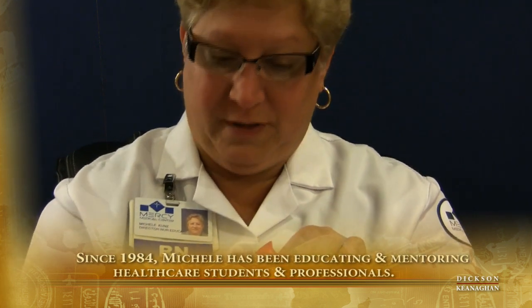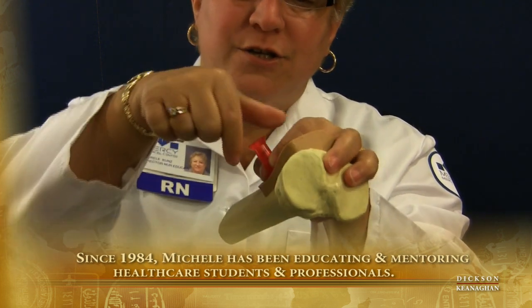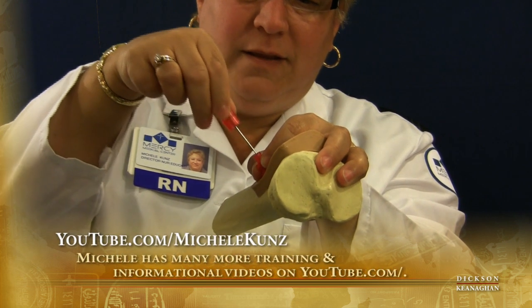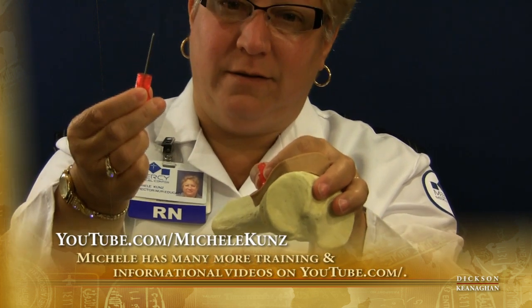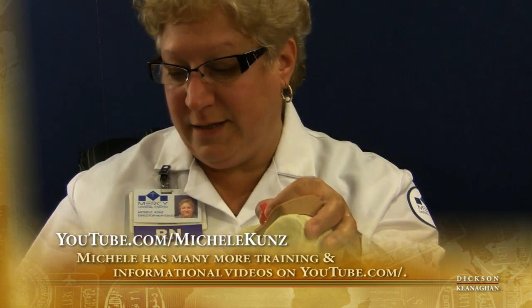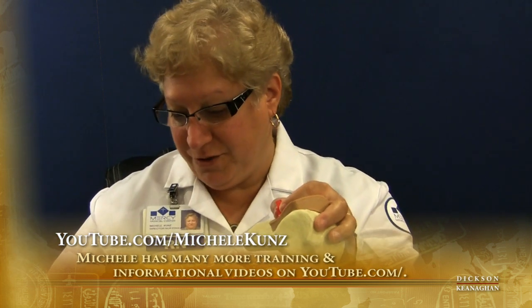So what I'm going to do now is grab the needle, pull the drill right off, put the drill down. I'm still holding onto the bottom of the needle. So when I unscrew the top, the inner cannula comes right out, right into my sharps container — or I could stick it into one of these little orange caps until I can get to a sharps container.